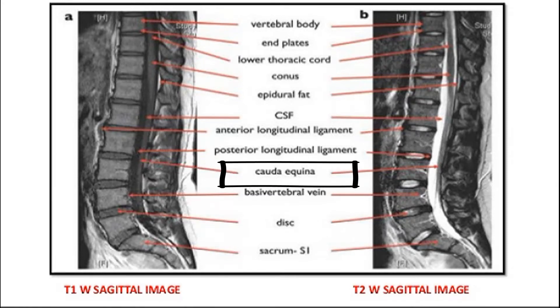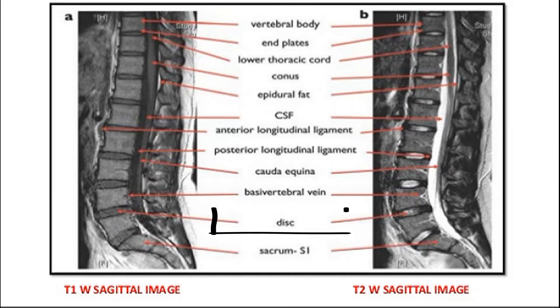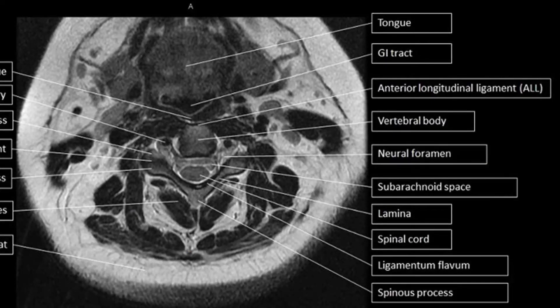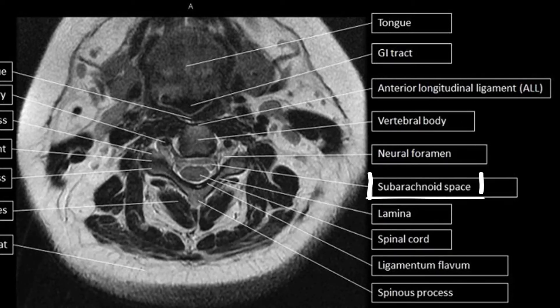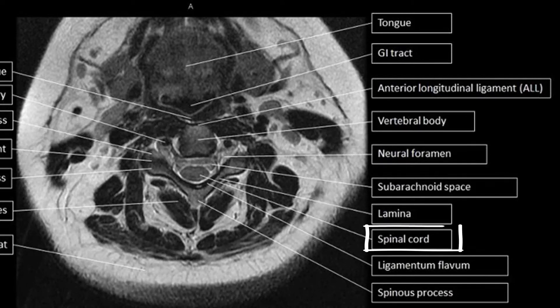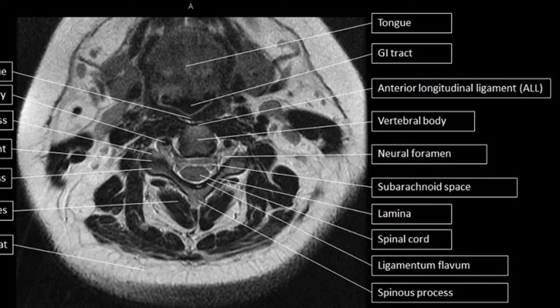Moving on to the axial view, this is the vertebral body, you have the subarachnoid space, and you have the spinal cord. In T1, the CSF is black or hypointense, and in T2 the CSF is white or hyperintense.